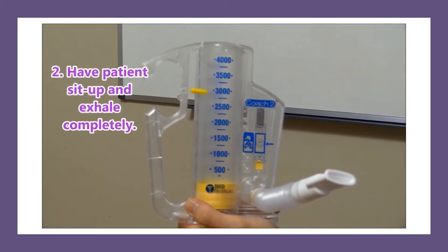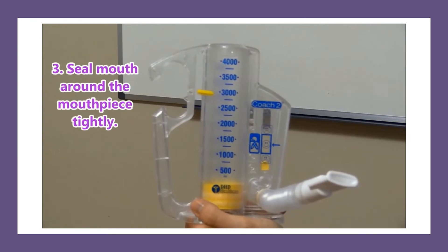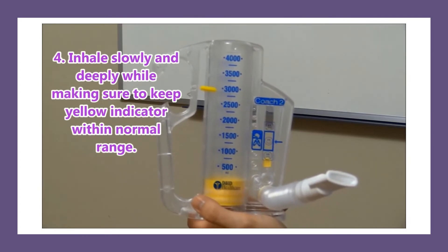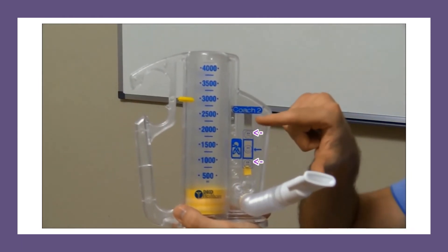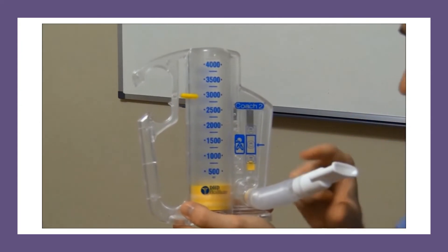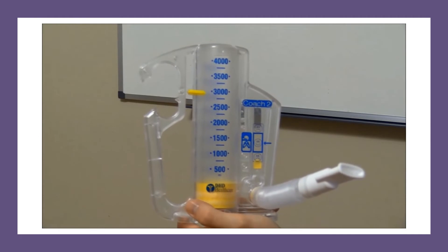Then you're going to have the patient sit up and exhale completely, then have them seal their mouth around the mouthpiece tightly, and they will inhale slowly and deeply, making sure to keep the yellow indicator on the side within normal range. They don't want that little yellow piece to go too high or too low. As they do this, the piston will rise up — have the patient keep inhaling as deep as possible until they can't inhale anymore.